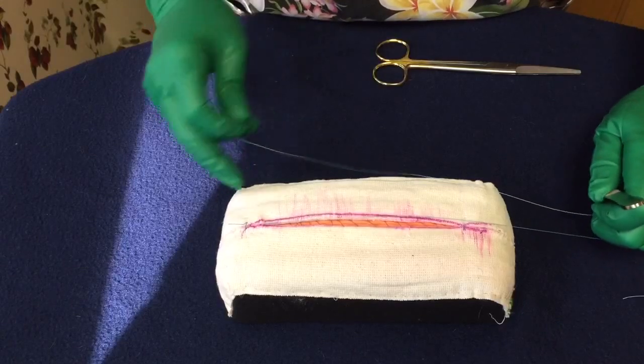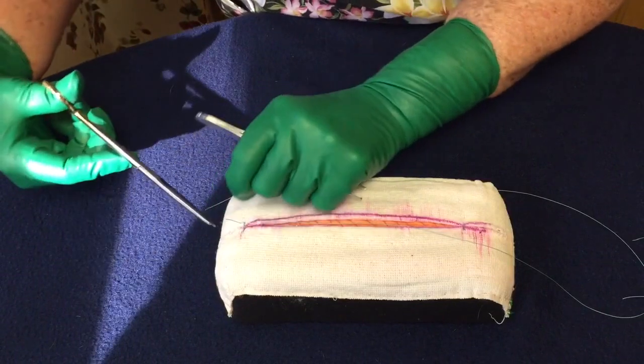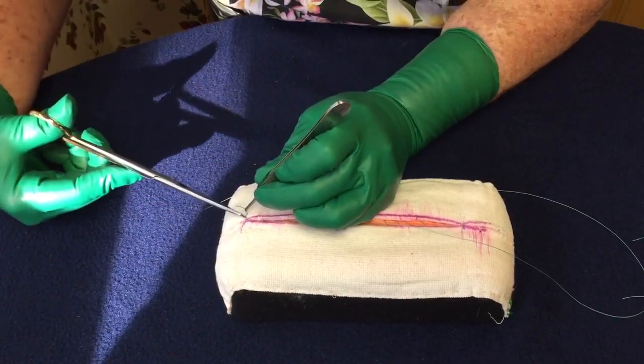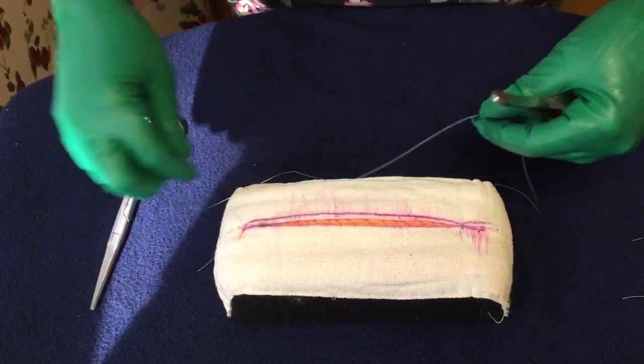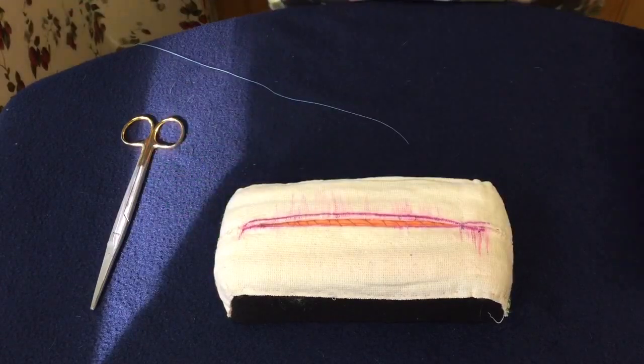So that's another way — when you're ready you could just cut that out, just like the doctor would on some that have simple stitches on the outside. He'd cut that and all you'd have left is the inside running subcuticular.